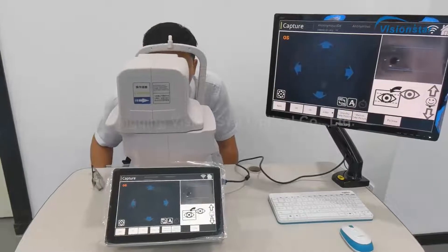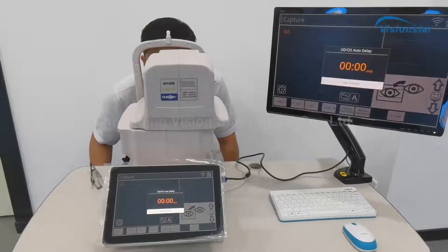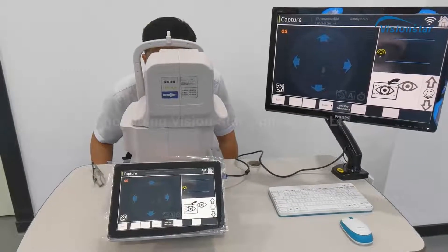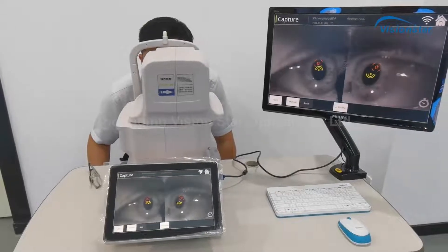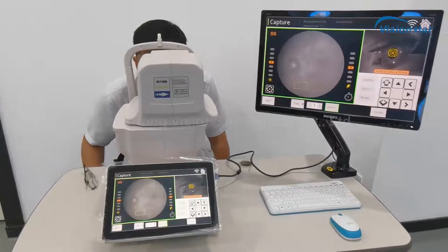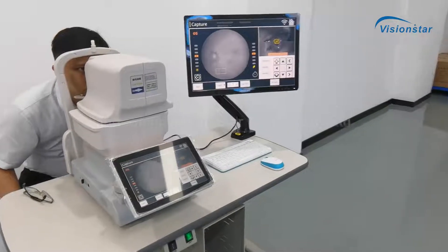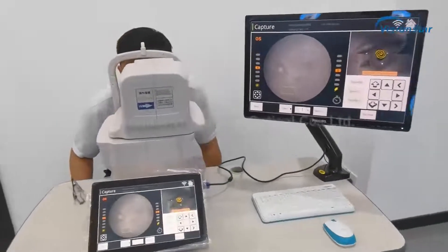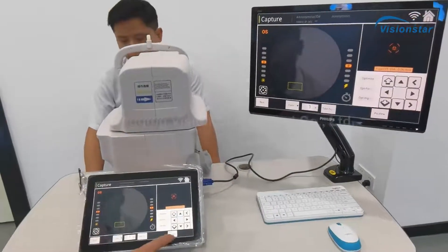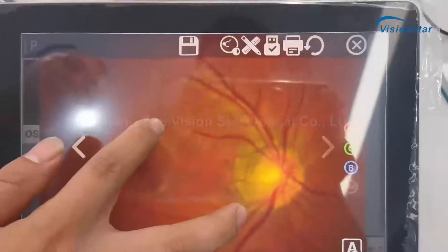Now it changes to the other eye. It adjusts automatically, auto-focuses automatically. You can see it takes the photos. Finish — you can see this is one eye captured.